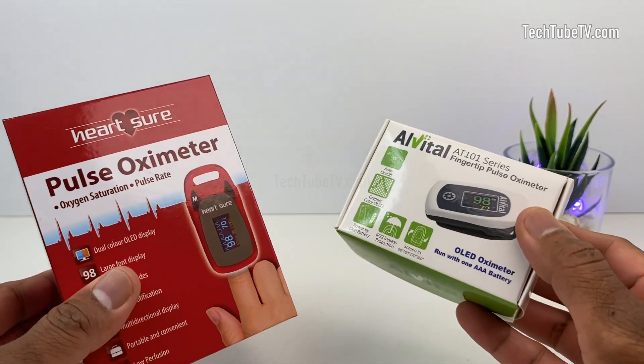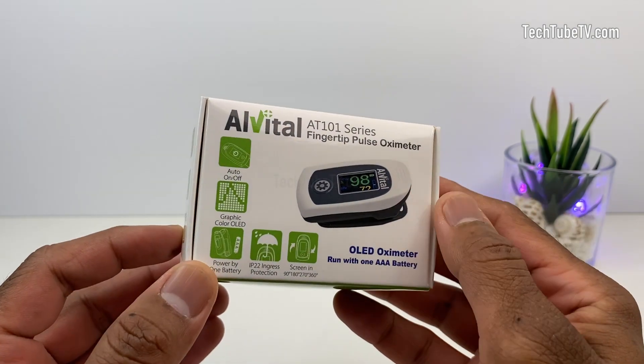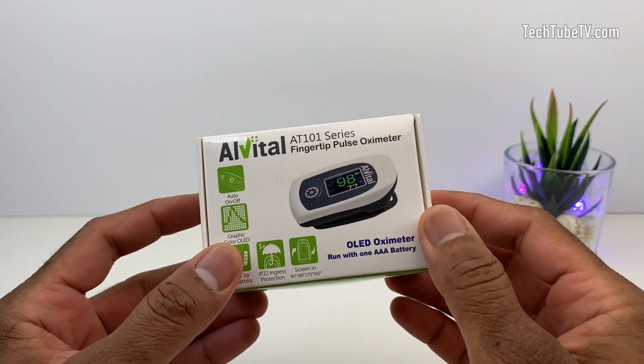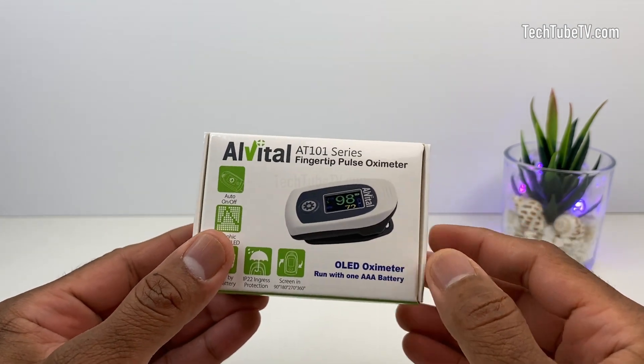There are various models of pulse oximeter devices out there, and this is one of them — the Alvital fingertip pulse oximeter from a company called Lead Tech Research. In this pulse oximeter review, I will also show you how to correctly use a fingertip pulse oximeter and identify the safe reading levels.